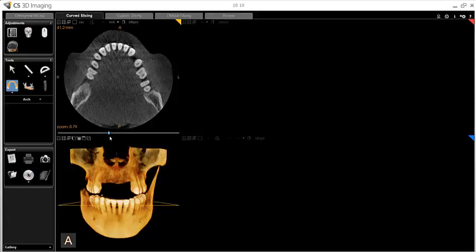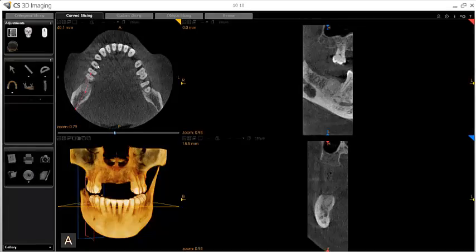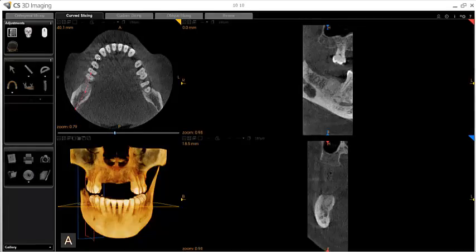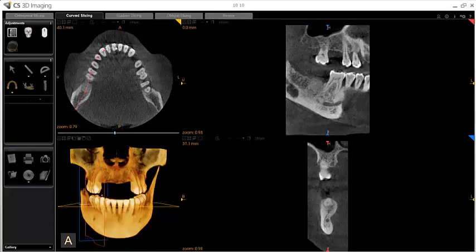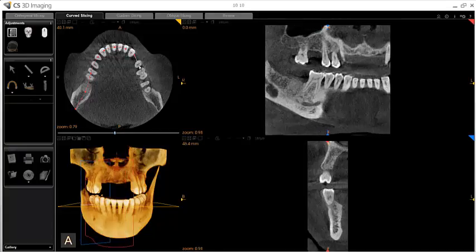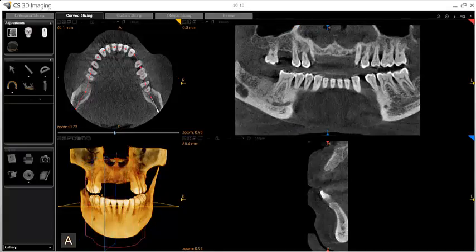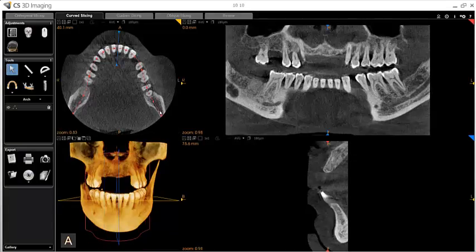In the Tools panel, click the Manually Create an Arch tool. Then, moving to the axial slice, do a series of left clicks along the arch to set the control points of the curve. The curve will be drawn in red, and as each point is added, the panoramic image in the upper right is dynamically updated. When finished, double click to set the last control point on the curve.